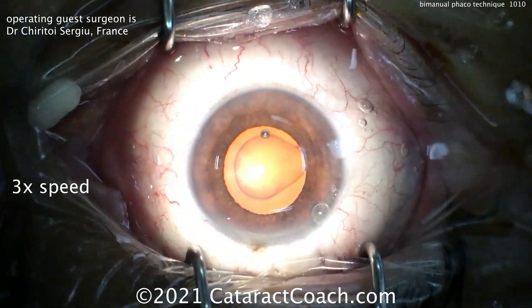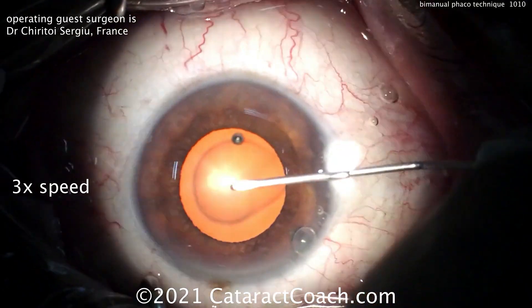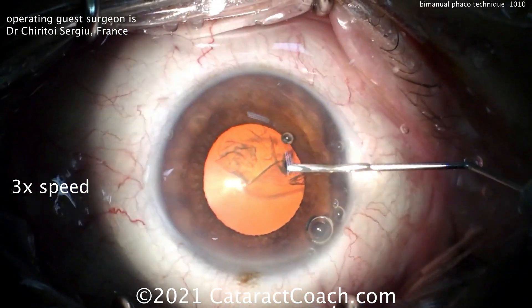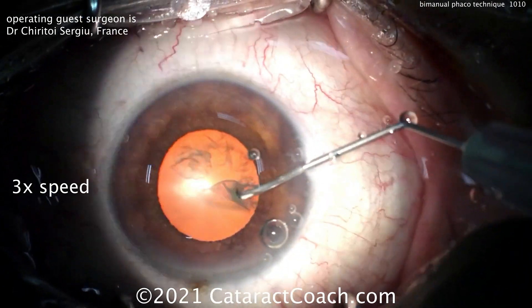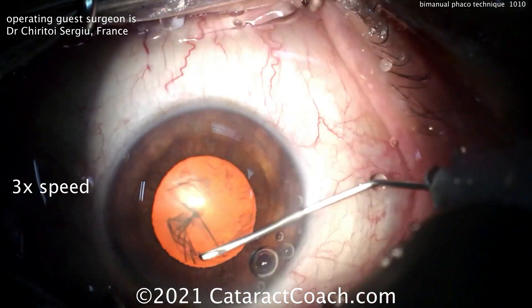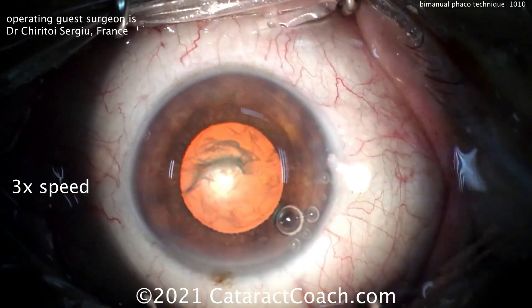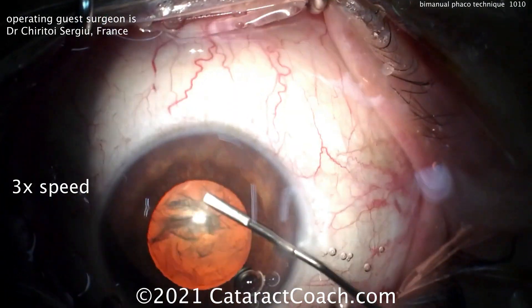Using the bimanual technique means that there's a separation of the infusion from the aspiration of the FACO. Many people are used to doing bimanual surgery already for cortex removal — irrigation-aspiration. Vitrectomy is typically done in a bimanual approach and not coaxial. So why do we still do FACO with a coaxial approach? This was the thinking about 15 to 16 years ago, when bimanual FACO started to become popular.